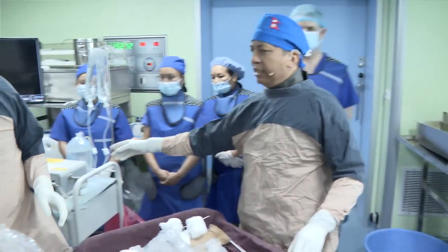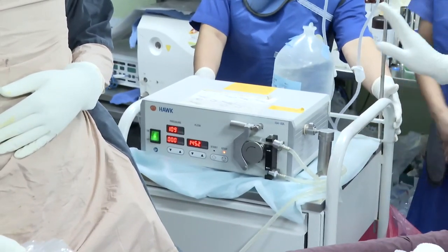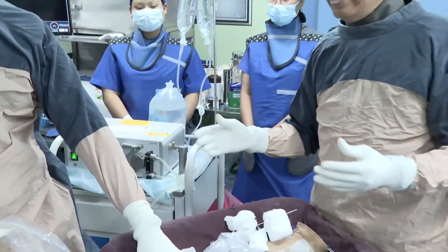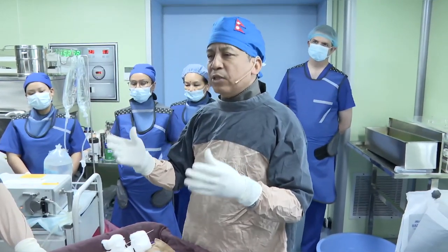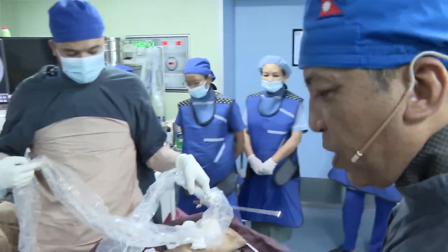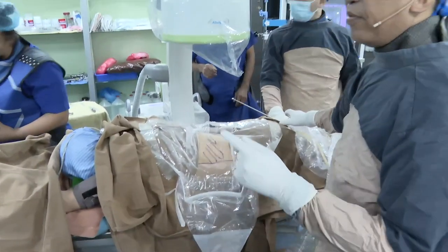Here is the pneumatic lithoclast — I have been using it for 18 years. For the irrigation pump, I use it when I have big stones, but if the stone is less than 20 millimeters I just hang a bottle of 1.5 liters with gravity.